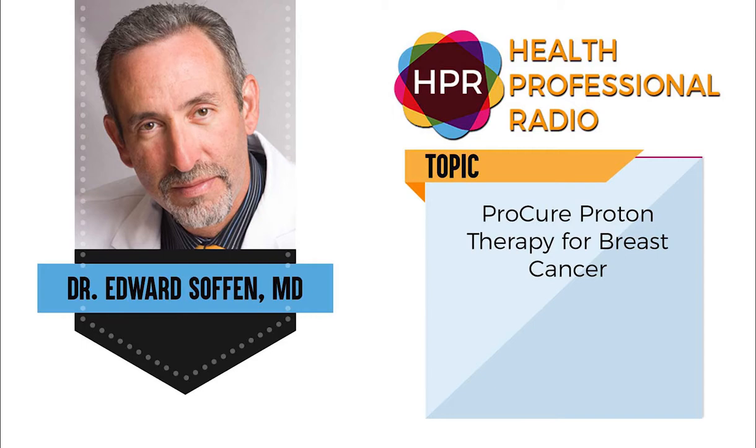Right. Well, proton therapy is a type of radiation, unlike conventional X-rays, which go into the tissue and go through it and out the other side like any kind of X-ray. A proton is a highly energetic particle, and we can create beams of these particles that travel at almost the speed of light, and they stop. They can be focused and targeted right into the tumor, or in the case of breast cancer, right into the breast, or right into the lumpectomy cavity.